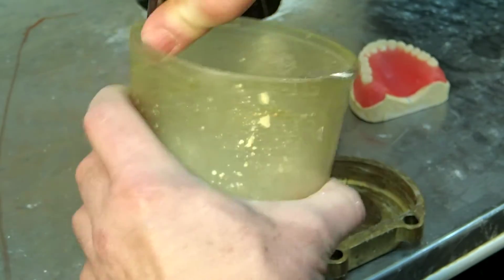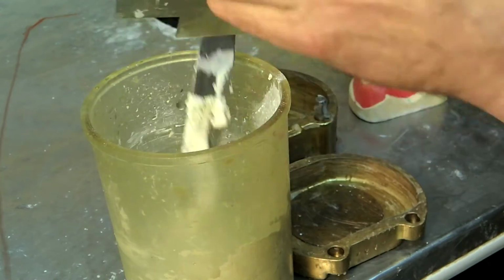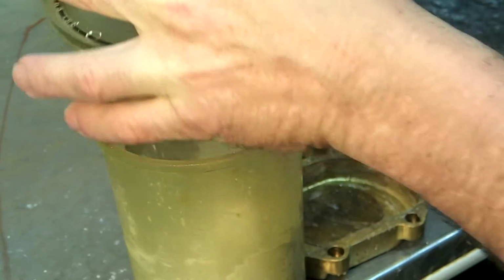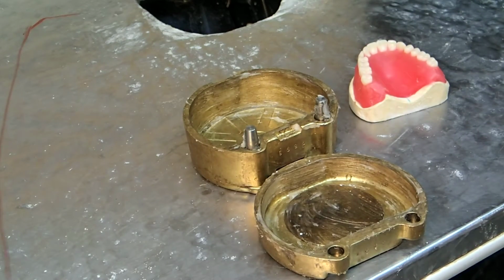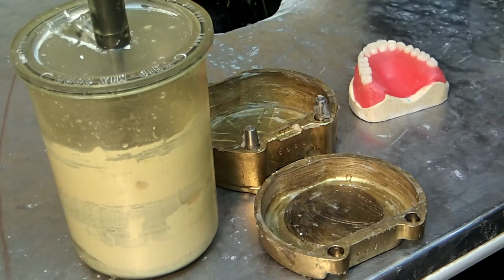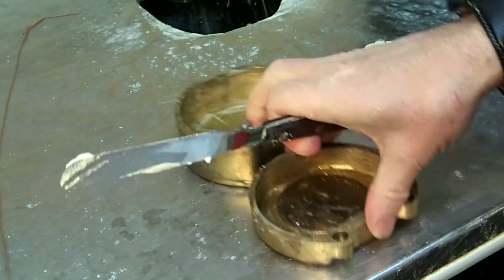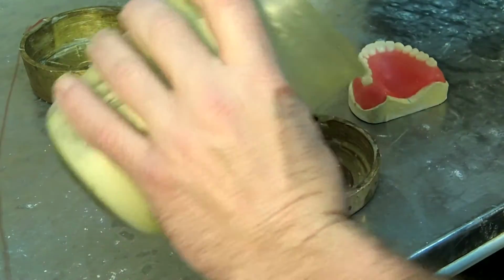I want this to be a fairly thick mix. I'm using a vacuum spatulator. I always use a vacuum spatulator to mix my stone for flasking. And there we are. Let's vibrate this a little bit. Now I'm going to put this into the bottom of the flask.